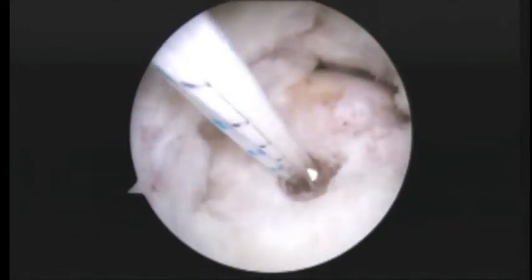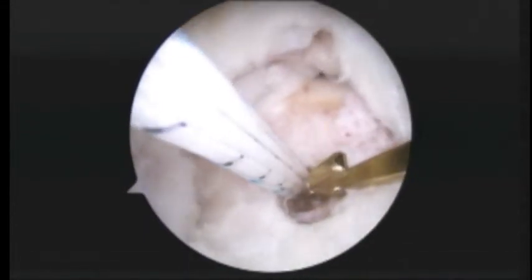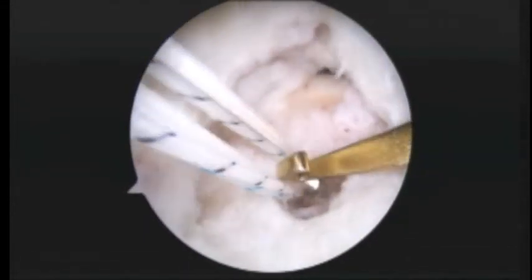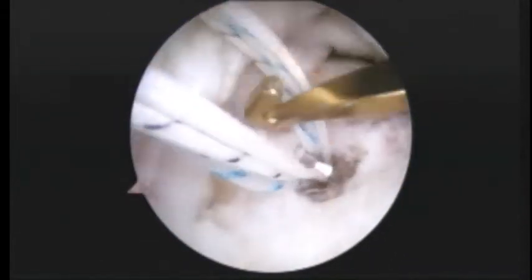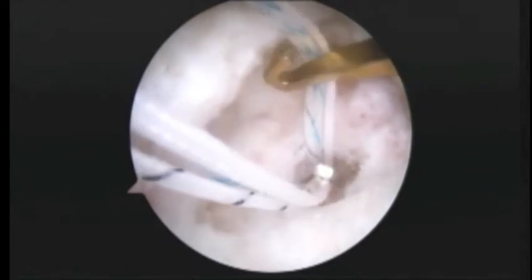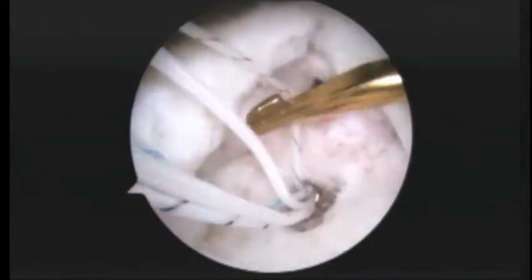We had a little cyst there in the bone, so we put a metal anchor in deeper through the cyst, and we have good fixation. You can just see the top of the anchor there, so it's actually not that deep. But that's what we had to do to get solid fixation. It's still triple loaded, and so now we're going to take the black and white striped suture on the left out the anterior cannula here.